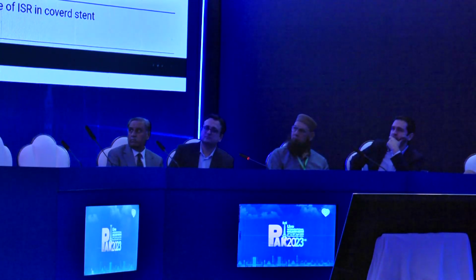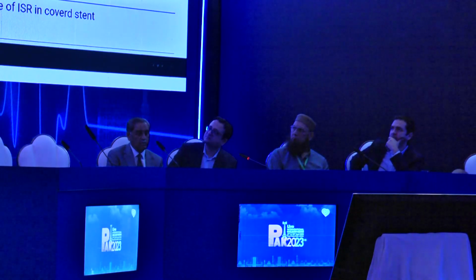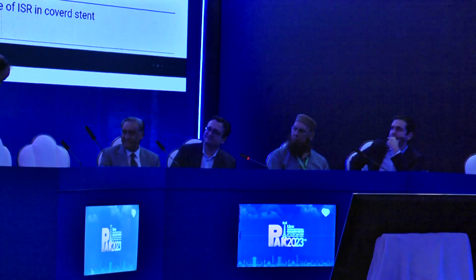Agreed, Don. So we felt it was a 0-1-1. The ostial circumflex, the angios you're seeing now are post-predilatation. So our plan up front was that we needed to stent both the LAD and the circumflex ostia all the way back to the left main. And then, of course, there's the ostial left main. The mid-body of the left main is actually not that diseased, but I don't think I want to leave any segment alone. So we're going to quickly post-dilate the LAD. Let me show you what that looks like, and then we'll decide on how to stent this bifurcation.